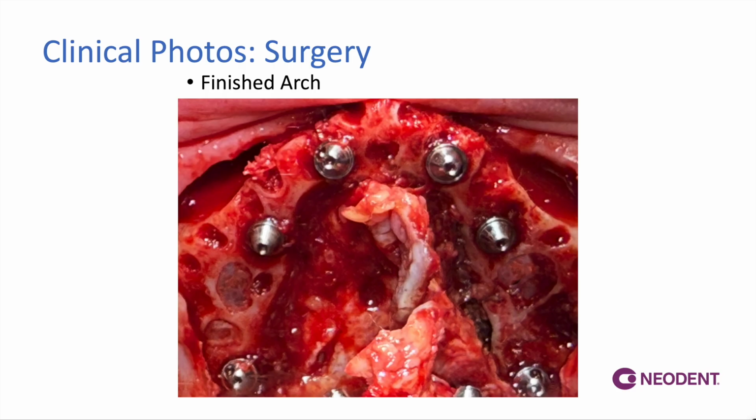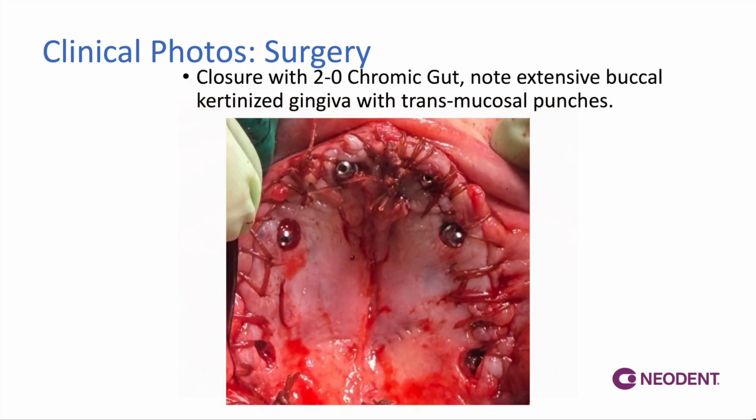And all of our implants are sufficiently palatal, not excessively palatal. However, they are not buccal either. We are trying to leave 2 millimeters of buccal bone to help resist any post-operative resorption, and we want to keep that buccal plate as alive as possible. Utilizing the posterior implants here, we are able to also minimize our cantilevers, and in fact, we have a no cantilever situation.